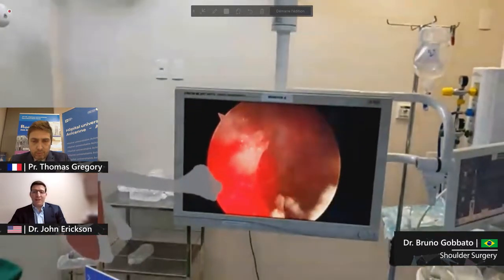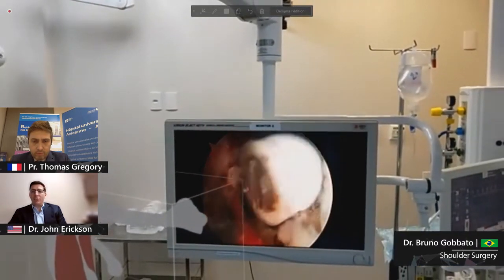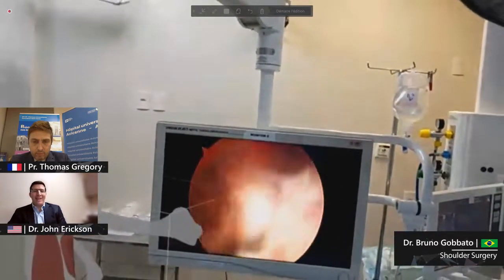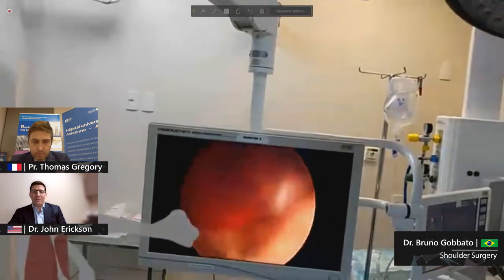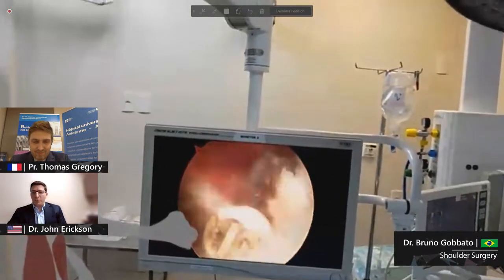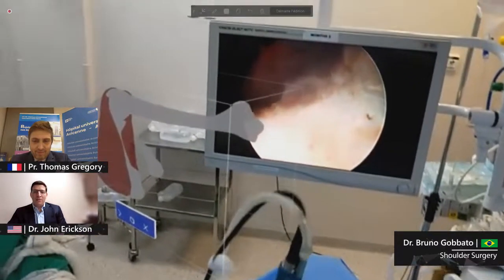As you've demonstrated, even in a case like this, you can use this to plan surgeries, to access information, to talk to other experts. And because it can be used again and again, it doesn't have to be sterilized. There are just so many ways that this augments, Thomas, to borrow your phrase, really, the augmented surgeon. This is what you've taught us, how you're adding layers of armor to your ability to do surgery.